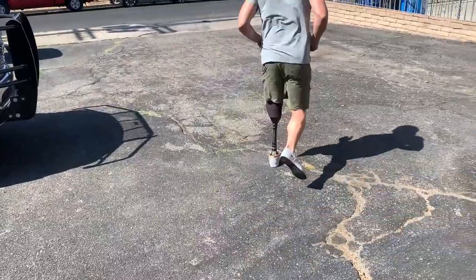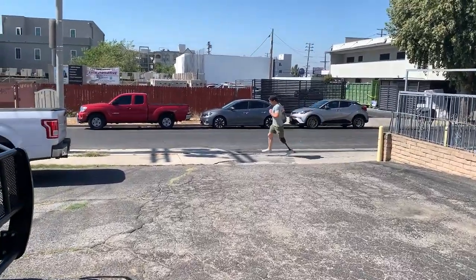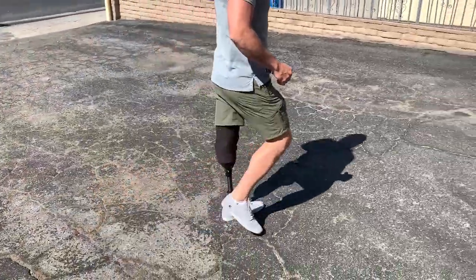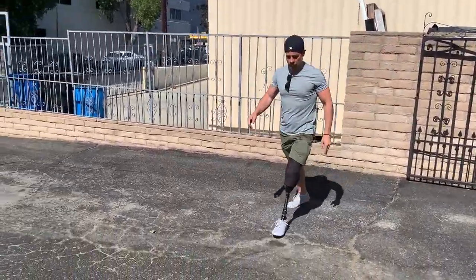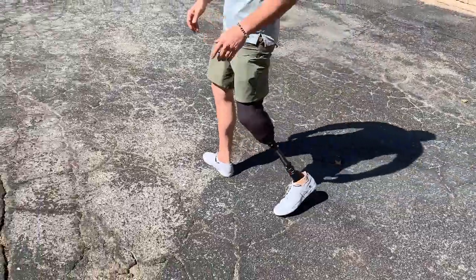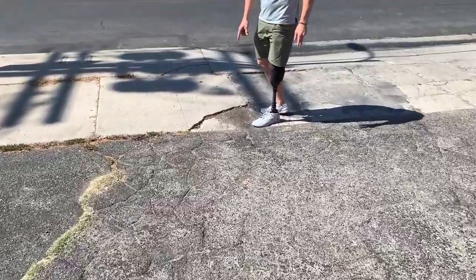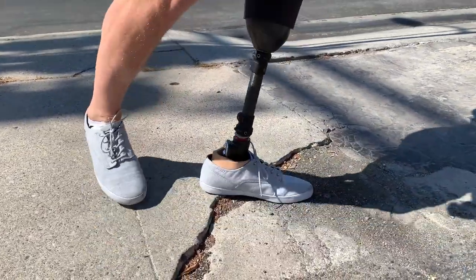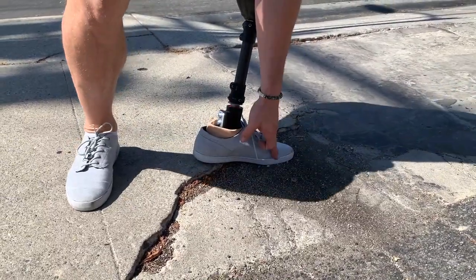Careful — I gotta lock-tight that thing. Famous last words. This is where I like to test something — there's a crack where it's off. That's where I always hurt my knee. It does pretty good — look at that roll. It's touching down there while it's here.